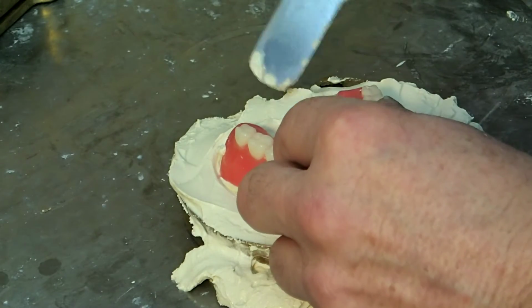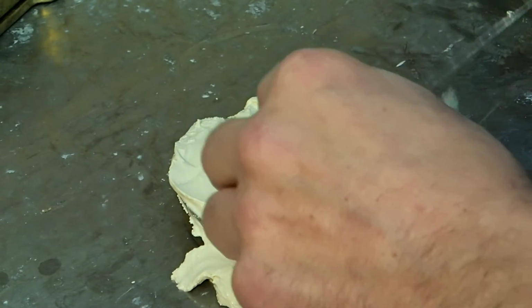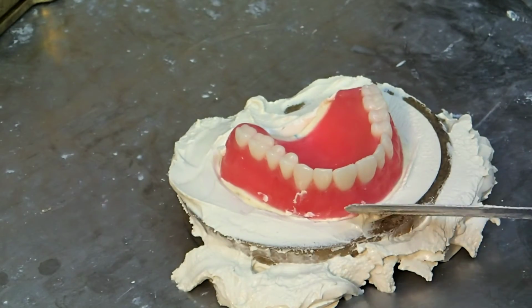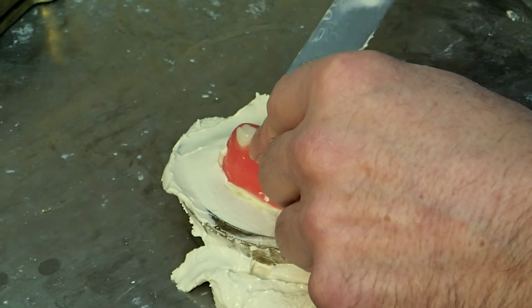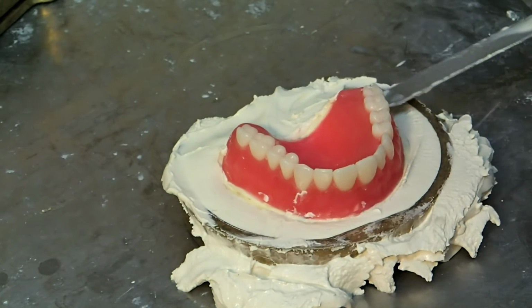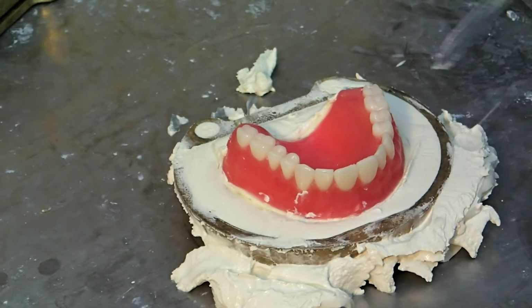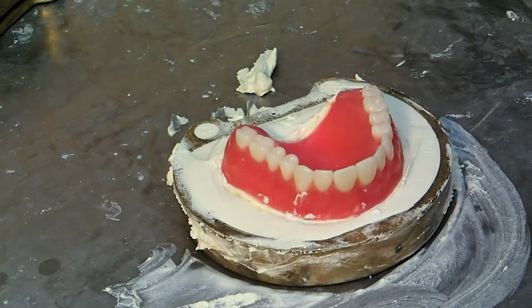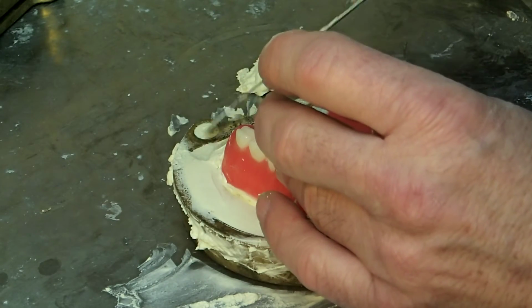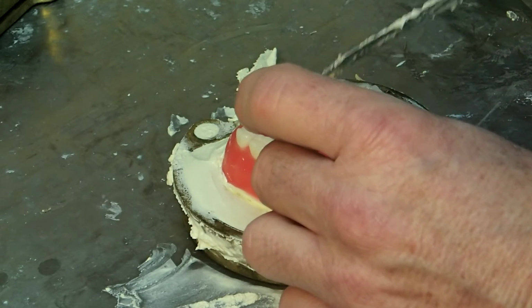And I'm just pulling the excess material out to the side of the flask. And now I can use my spatula and I'm just going to cut around at the height of the flask. So what I want is for the stone to fill all of the area under and around the model. And I want it to be smooth with the flask, and I want the metal of the flask to show perfectly clean all the way around. And this stone should be nice and smooth. If I get a little bit of stone on the wax there, I'm not going to worry about it. The stone's not going to stick to the wax. I can clean that off later. All I'm trying to do now is make sure that everything is nice and smooth.